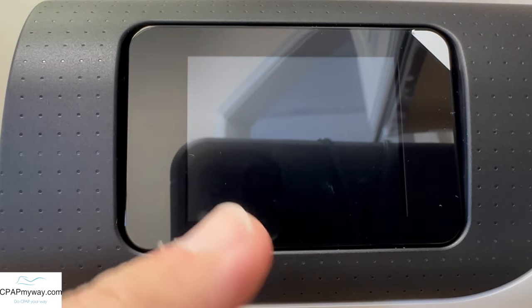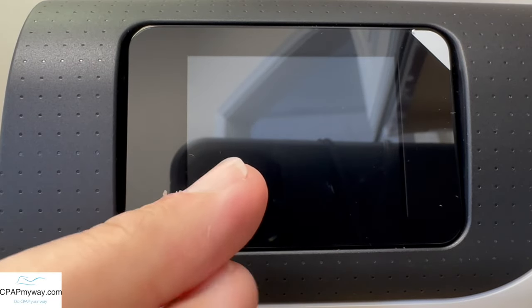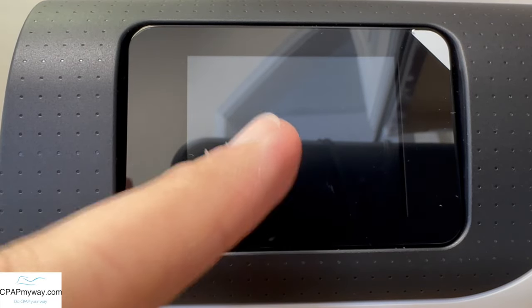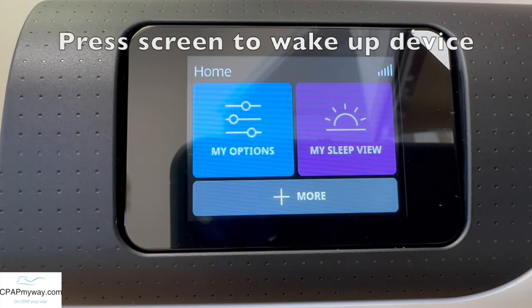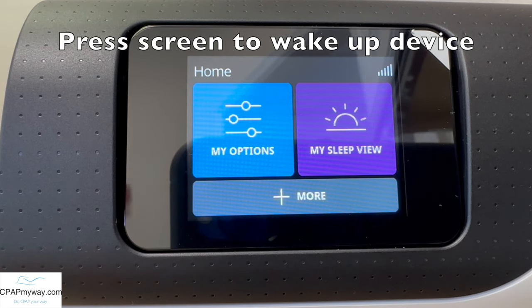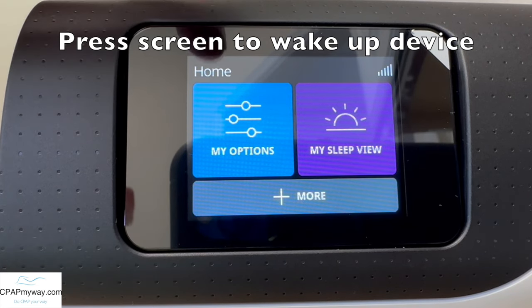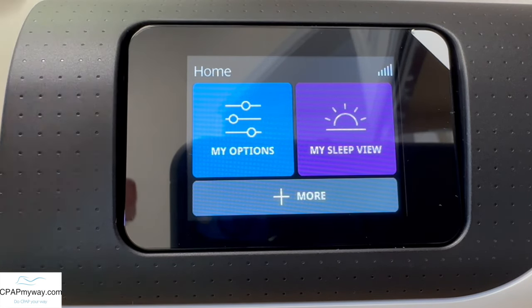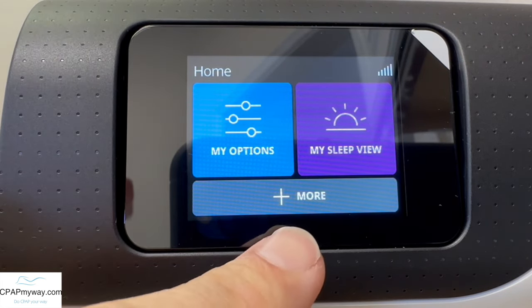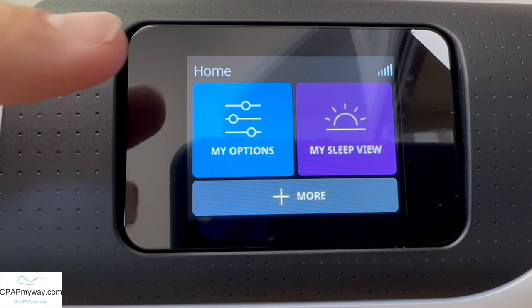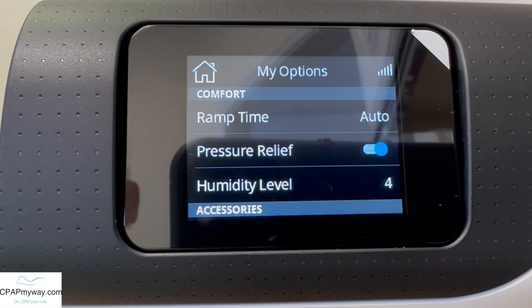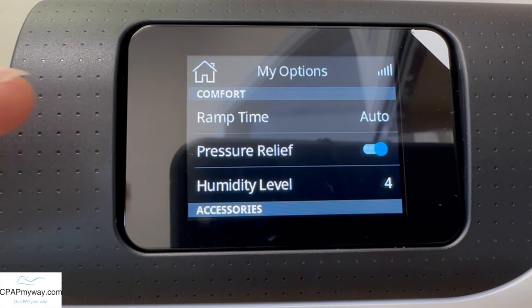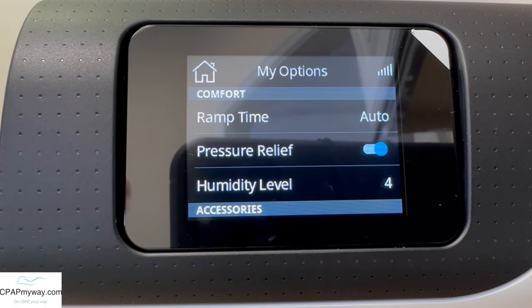When you've got your machine plugged in, you may notice that it's dark to start with. To wake up the machine, just touch the screen. You'll see the options pop up. You're gonna see three things: my options, my sleep view, and more. We're gonna start off with my options, so press the little blue icon there.